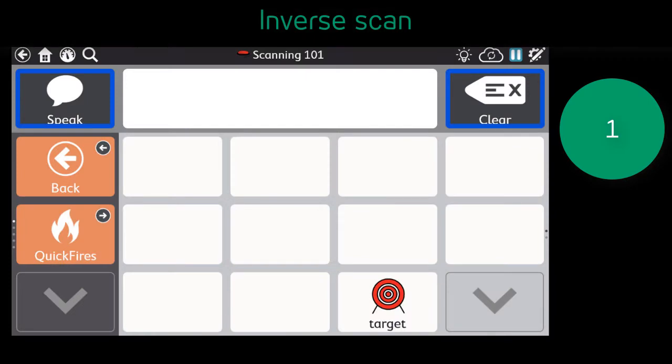As we watch inverse scan in action, the user will select and hold the switch until the scan advances to the desired row, column, button, or group. The user will then release the switch to select.